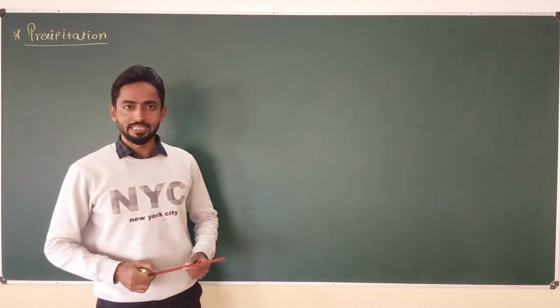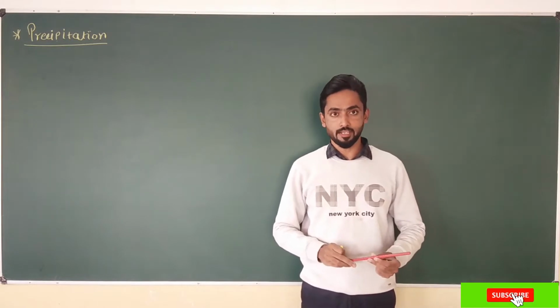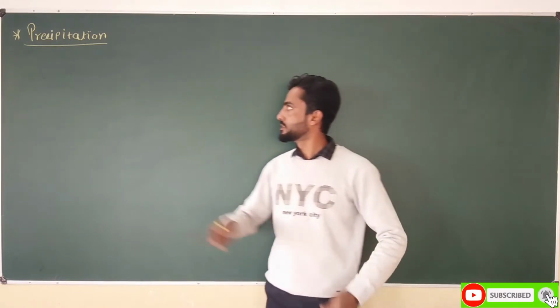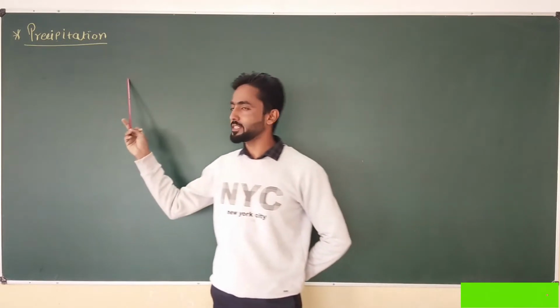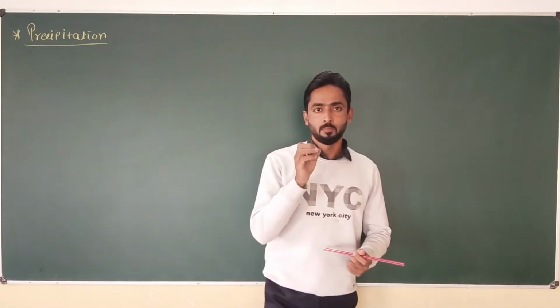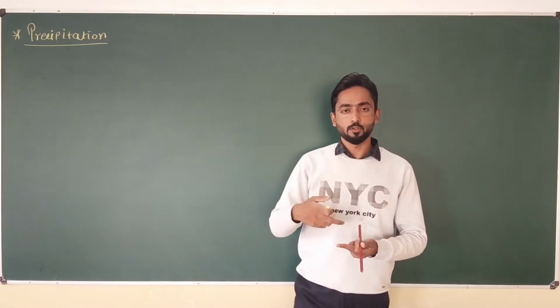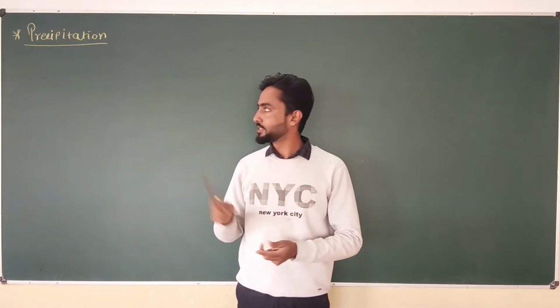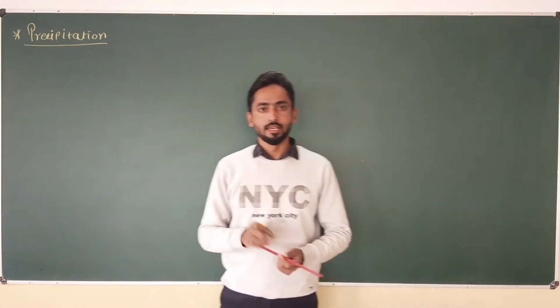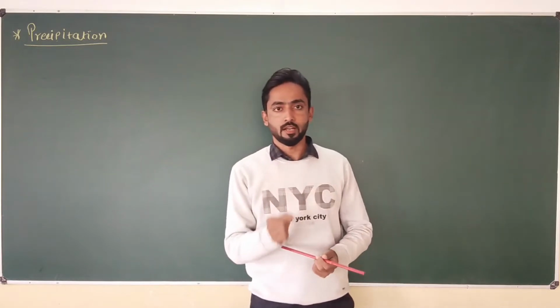Hello everyone. In this video series, we are talking about different types of antigen-antibody interactions, and well-known examples are precipitation and agglutination. In case of precipitation, a soluble non-particulate antigen combines with its antibody to produce a visible precipitin complex or visible lattice, and this precipitation reaction only occurs in the presence of an electrolyte like NaCl at optimum temperature and pH.